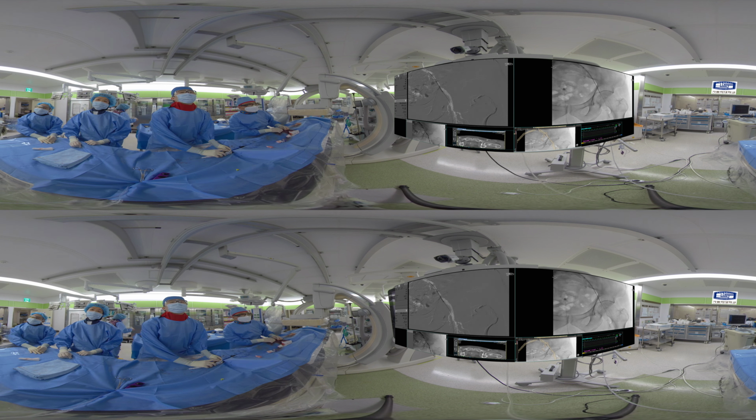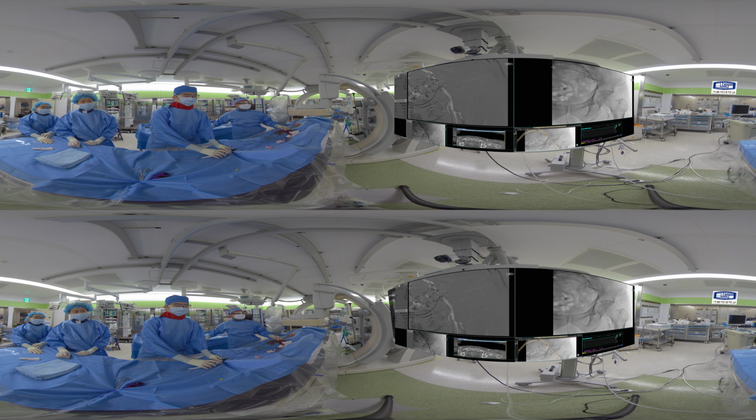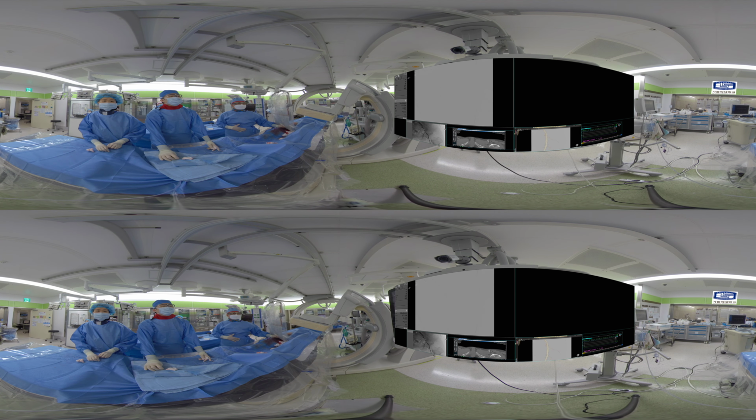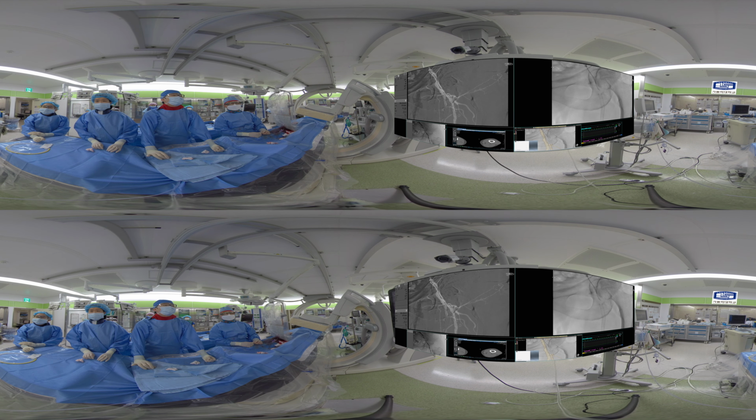Angiogram showed the restenosis in the left iliac artery, and stenting was done in the left external iliac artery with an 8 mm EPIC self-expanding nitinol stent. Then an angiogram was done to check the femoral artery runoff and showed that the stent was occluded, with collateral deep femoral artery runoff.